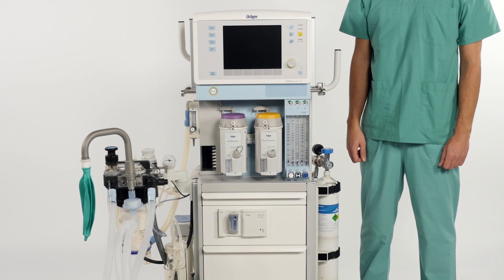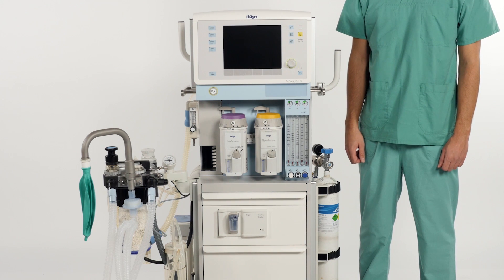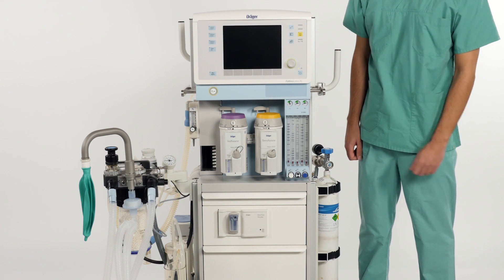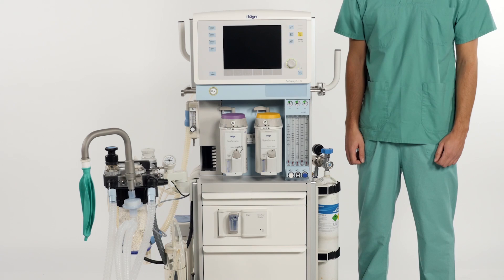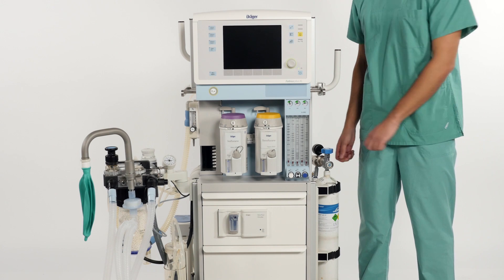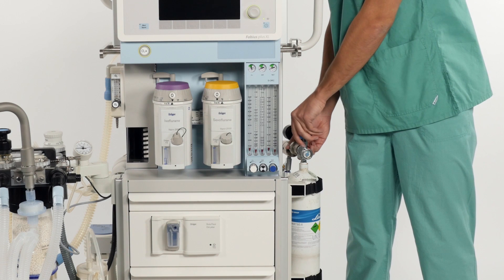First, connect all gas supply hoses and the power supply cable. In this case we will only use oxygen for gas supply. To check that all medical gas connections are connected properly and securely fitted, verify that the pipeline pressure is within an acceptable range. To check the filling levels of any gas cylinders you might have, simply open the cylinder and check the pressure.